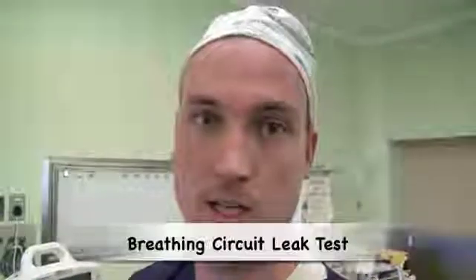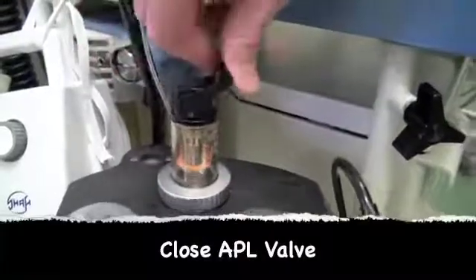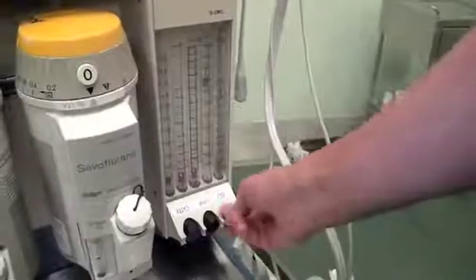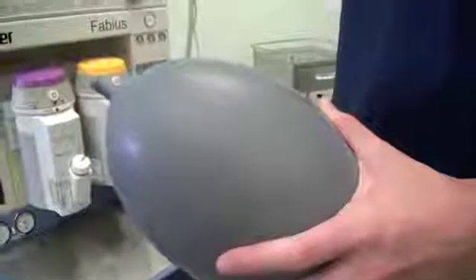One now needs to test for leaks within the breathing circuit. This is done by closing the APL valve, building up pressure within the breathing circuit, turning off all fresh gas flow, and squeezing the bag to make sure that there are no leaks.